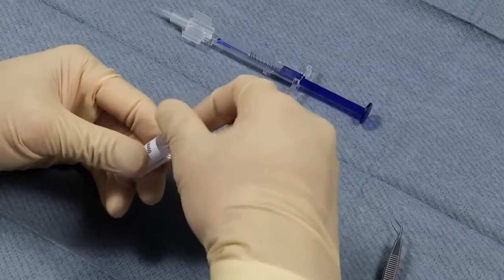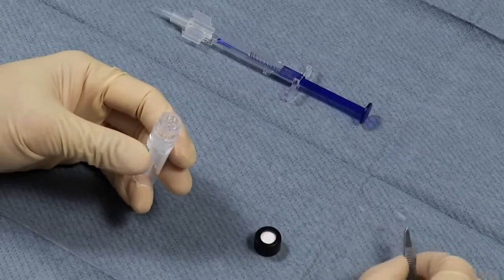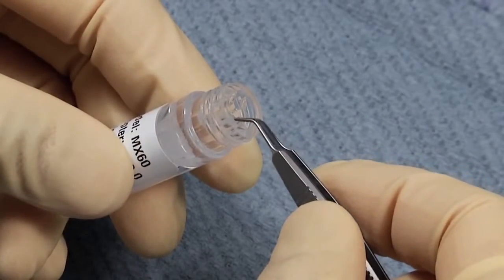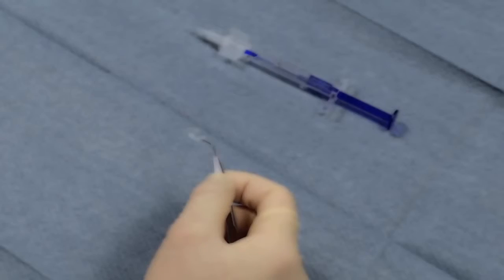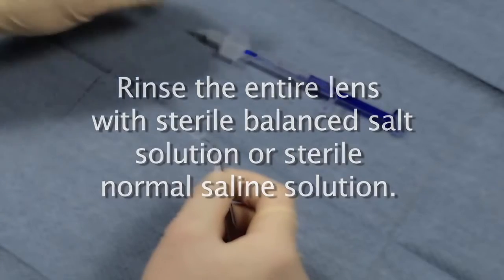Open the vial containing the IOL and using non-serrated forceps, remove the lens by grasping and carefully pulling it out vertically from the center slot at the top portion of the vial. Rinse the entire lens with sterile balanced salt solution or sterile normal saline solution.